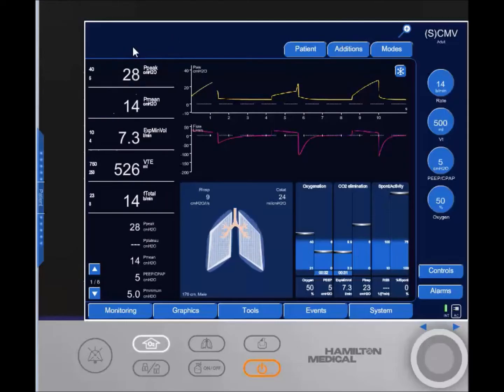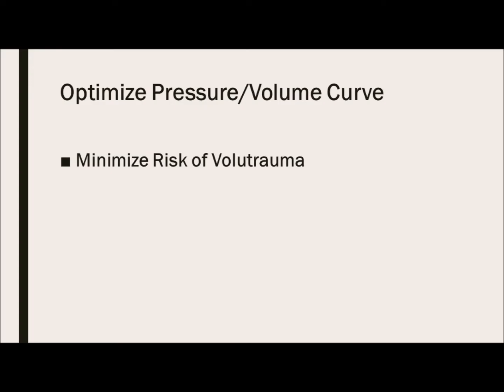So that's an immediate response. That's not the ventilator in between breaths adjusting my pressure to maintain this tidal volume at all. So volume control CMV with set point targeting does not have the feature or the capability to allow for automatic adjustment of support in response to changes of respiratory system mechanics.